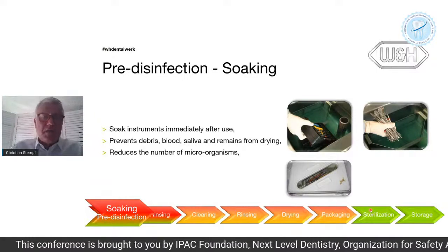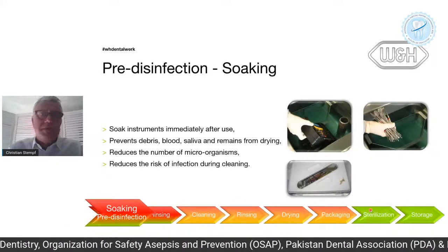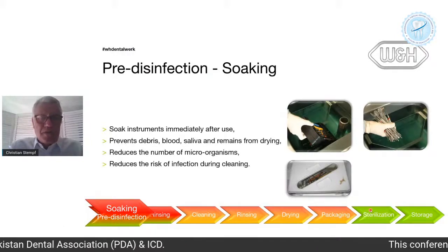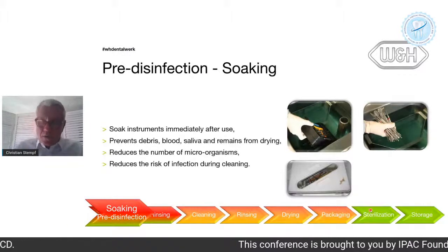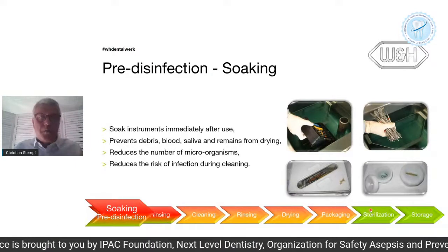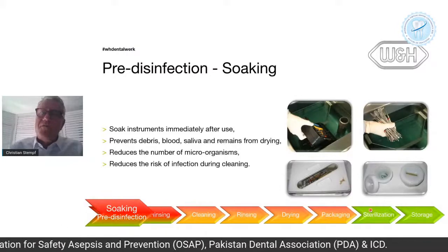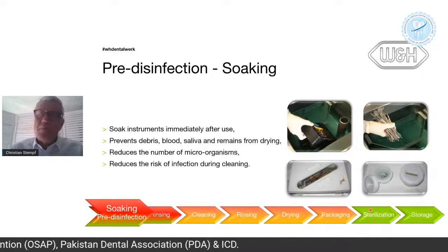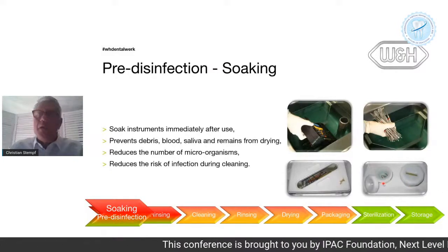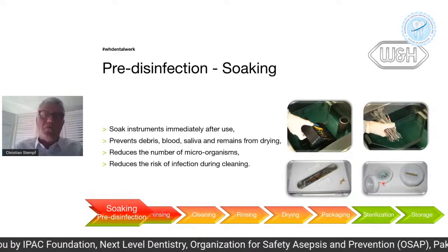And there's a good reason for this. It also prevents infection from staff. If, for example, you clean your instruments and you get a stitch and you cut yourself, and you have not disinfected, only washed, you're in trouble, aren't you? Now, especially burrs, they are still on the turbine. Burrs, to me, are not soaked straight away. I recommend to doctors, if you have a long procedure and you first start drilling, preparing a crown, take the burr, click, and drop it in this small tank. It will facilitate cleaning. If you need it again, then take another one. That's it. But please take a few seconds to soak your burrs.